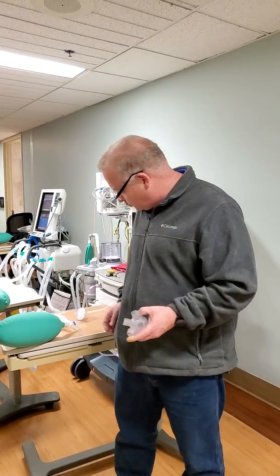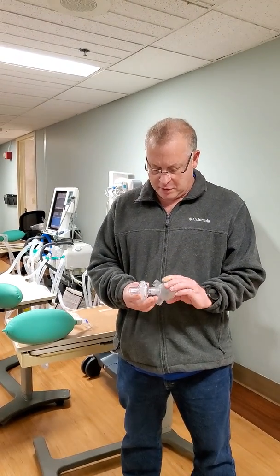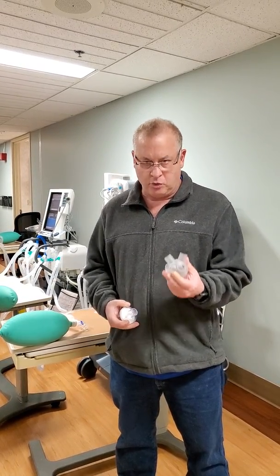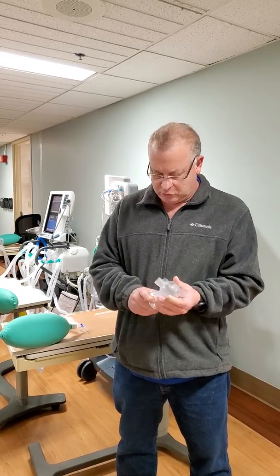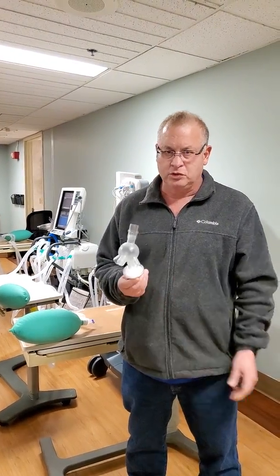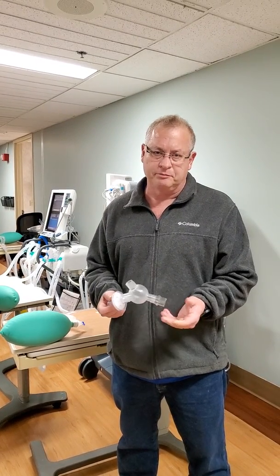We had problems with the ventilators interfering. So I came back, I redesigned it yesterday morning. I sent the files to Kevin Dyer at Intercode Models. He 3D printed this CAD model overnight and supplied it this morning. It's very simple, has 4 filters with a coupling that goes directly to the ventilator. There were no issues with interference between the round filters or the square ones.